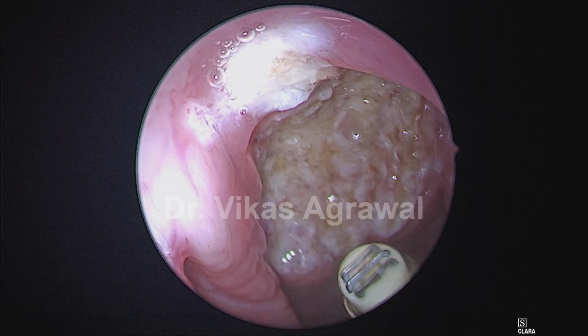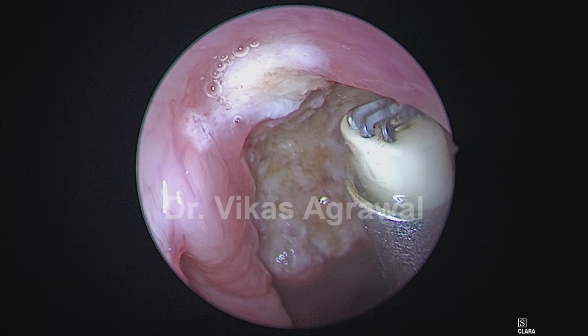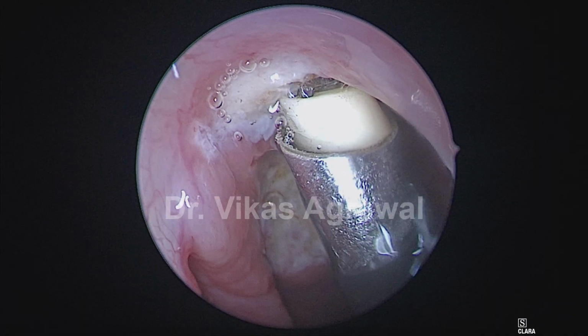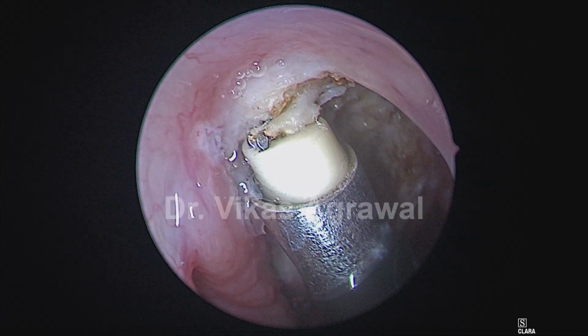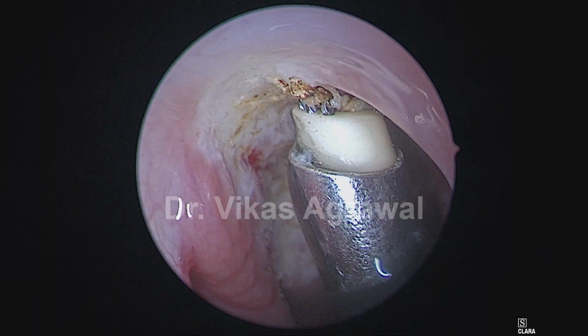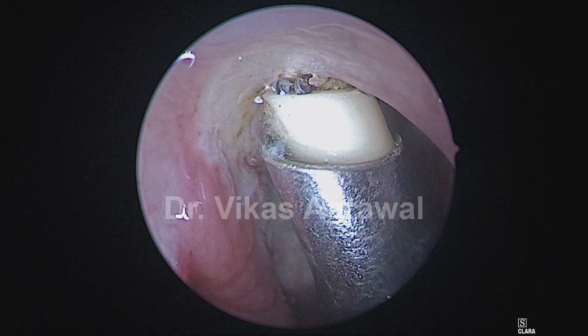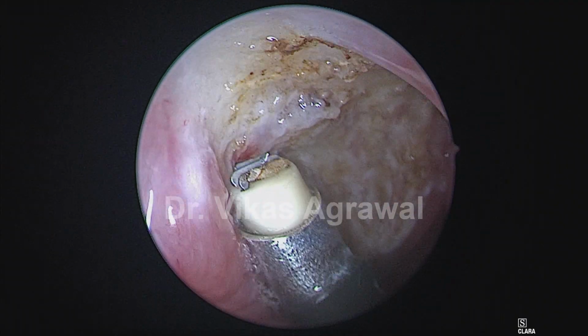So now this is the final stage in the adenoid when the major tissue has been removed. Now I'm starting with the superior boundary. Now see, I'm removing the last layer in the superior boundary, which is the periosteum below the sphenoid bone.